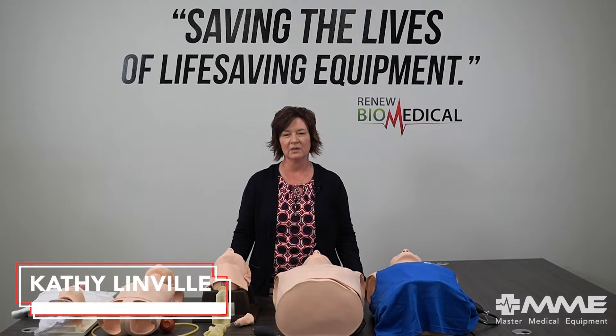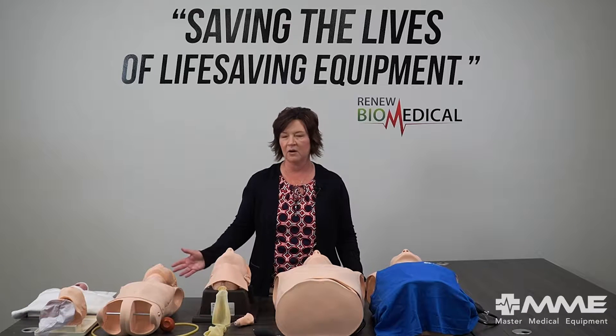Hi, my name is Kathy Linville. I'm from Laerdal Medical and I'm here with Master Medical Equipment today, speaking about our airway solutions.